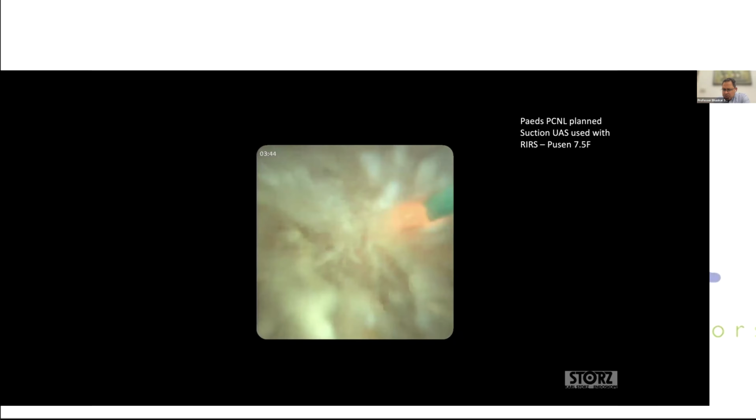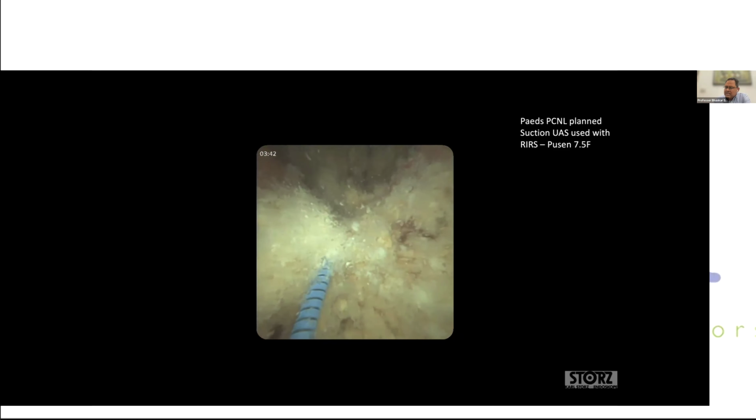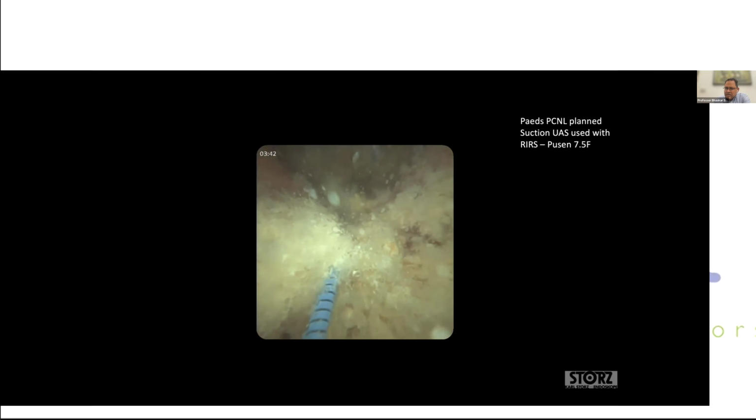So here you can see lots of dust and debris. I keep breaking. Luckily, the stone is soft. Once we break it, you'll see the suction sheath in action again. And all these fragments, all this dust, debris, mucus type material, you'll see it's getting sucked out bit by bit. And once you start doing that, how much can you do? How much do you have to suck? How much suction power is needed? Some of the answers we don't know. Only time will tell. And as I said, it doesn't always work as well and as efficiently in every case, but where it works, it is a treat. So in this case, it really worked very well for us.